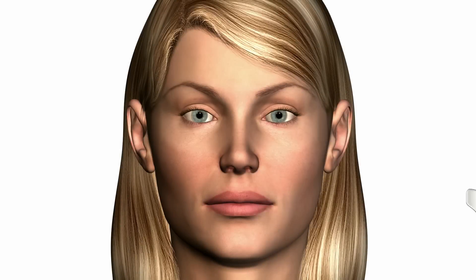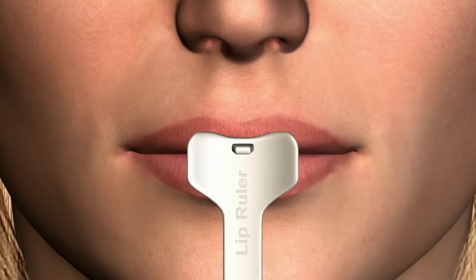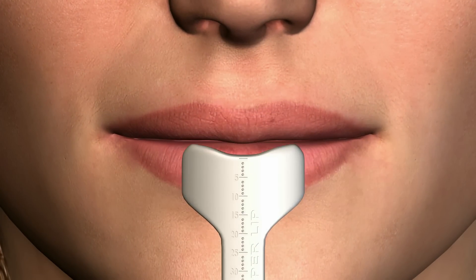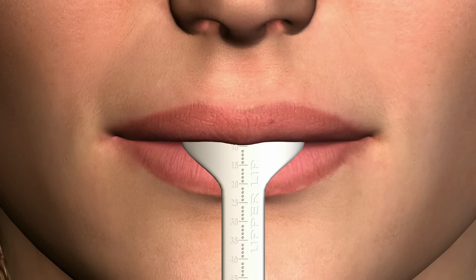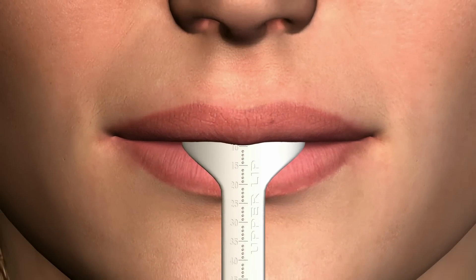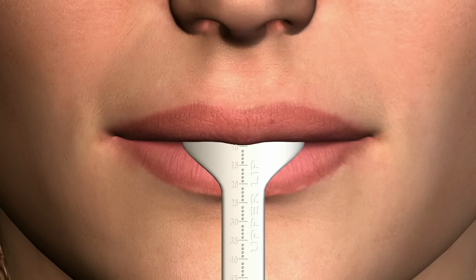For the maxillary arch, slide the upper half of the lip ruler under the upper lip until the horizontal stop rests on the pre-maxillary ridge crest. Have the patient totally relax the upper lip, read the number on the front of the ruler at the lip height, and record this measurement as the resting lip position.